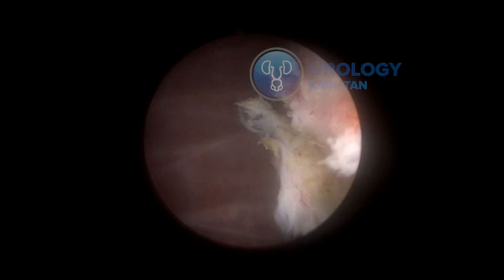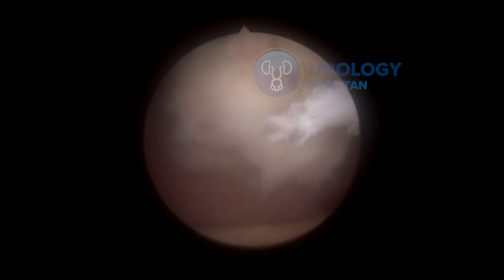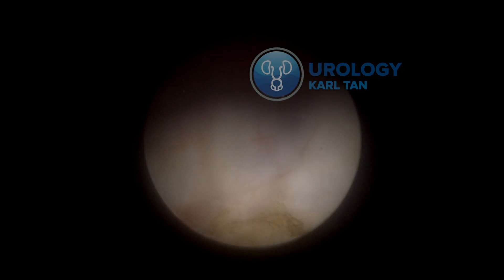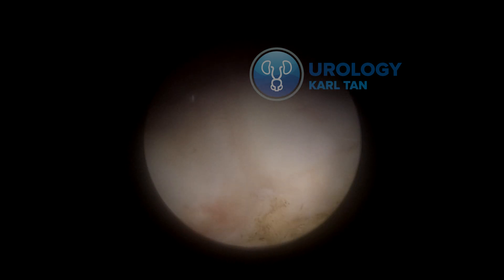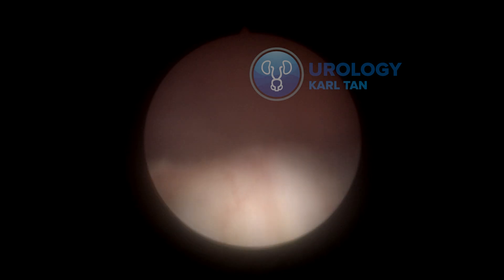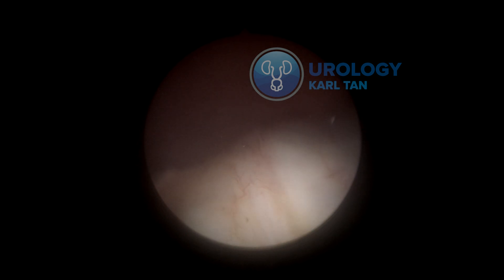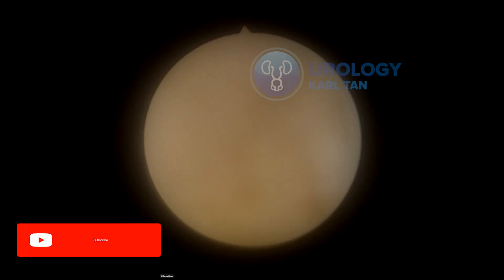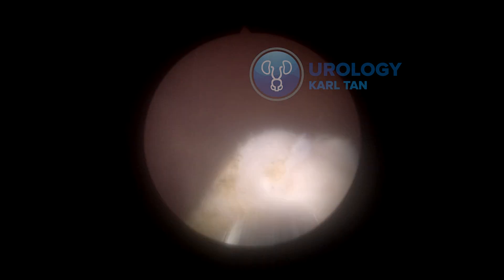We're using the Jaws Morcellator from Hawk — it's doing its job pretty well. It's very nice to see your enucleated prostate floating around inside the bladder without any bleeding. I keep the bevel of the morcellator blade up. I know some would do the inverse, but I'm more comfortable doing the morcellation this way. I feel like it's more logical, though I know there are advantages to doing the reverse.